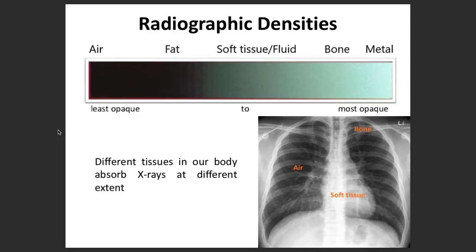hold a very important role in front of us to help us tell the story of diagnosis for the patients. Okay, so to tell you, chest x-ray, yes, indeed sounds very simple and very nice, but when we look into detail, it's a very interesting thing, not just for the radiologists, but also for the cardiologists as well. So let's try to have a little bit of brief outlook.